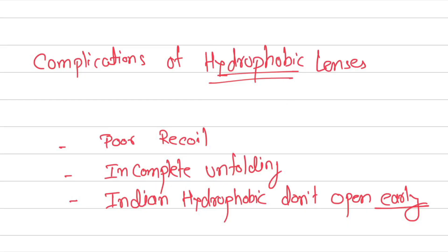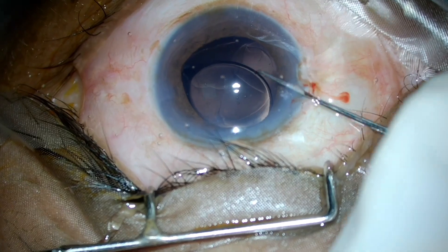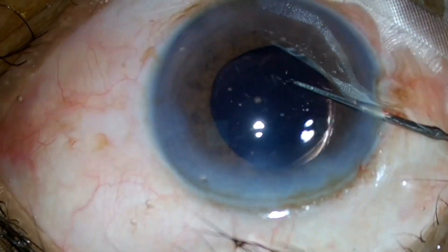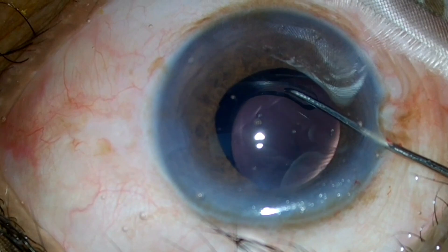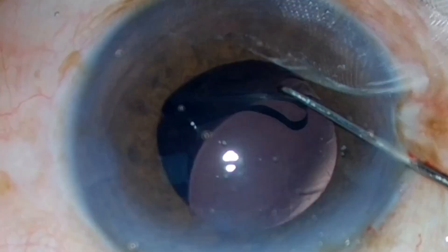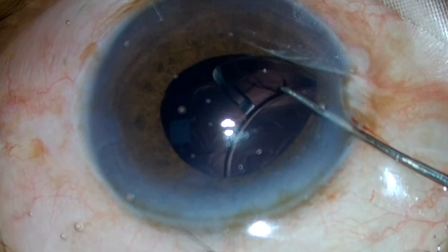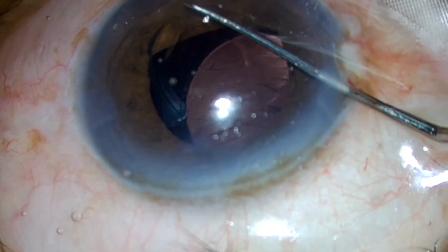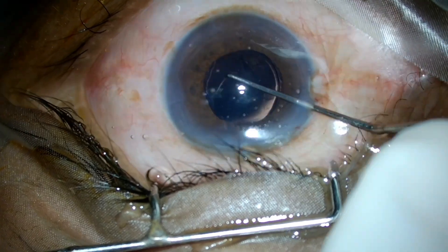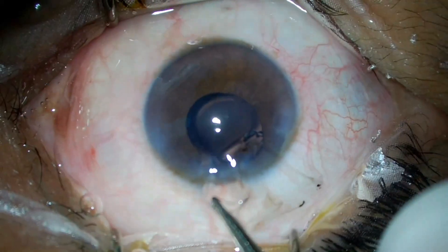As is well said, we build on our success and learn from our mistakes. Here is a case of a primary folded haptic. The bag is distended with viscoelastic and the folded haptic and part of the optic is found outside the bag. The folded haptic is pulled and unfolded, and the haptic-optic junction is pushed into the bag. Early intervention is necessary in such cases.